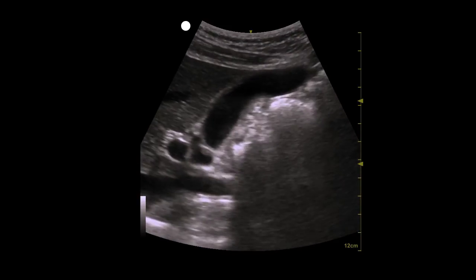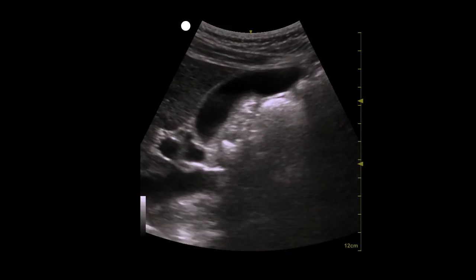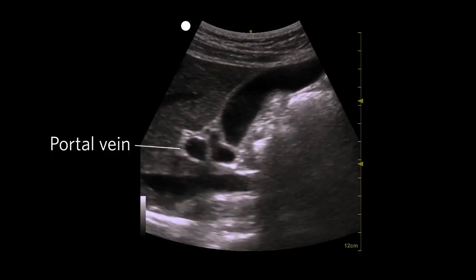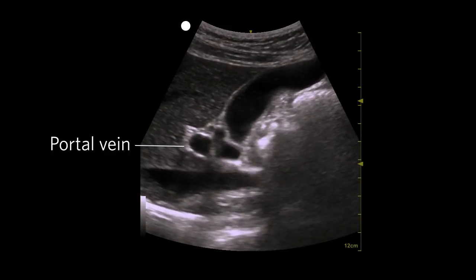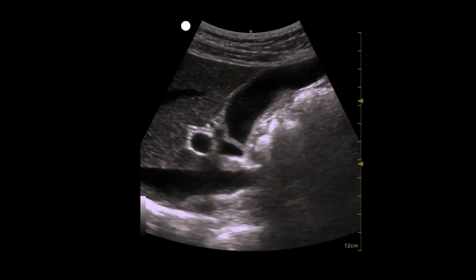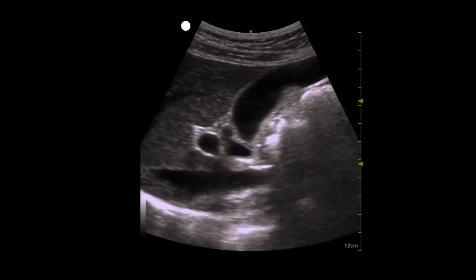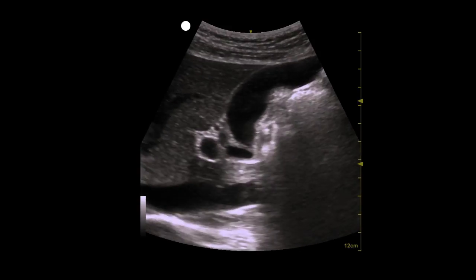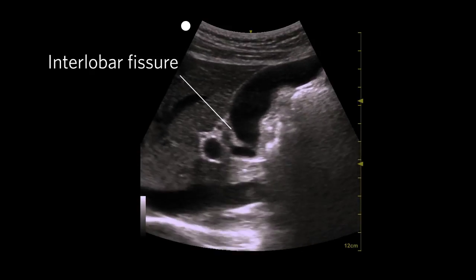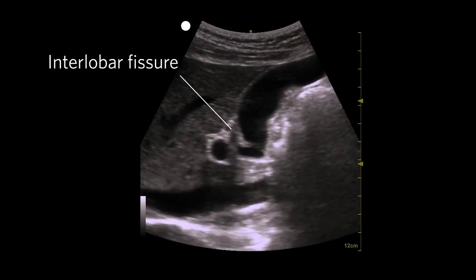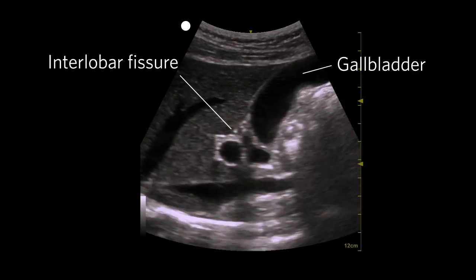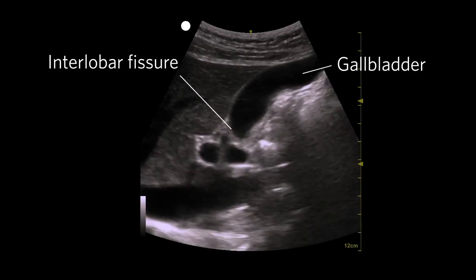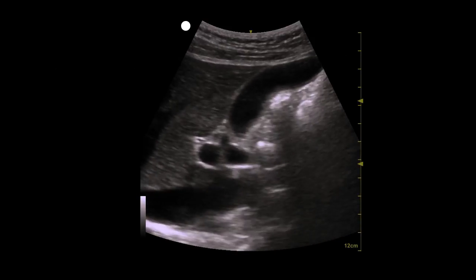Slide the probe laterally along the costal margin until the portal vein comes into view. The portal vein is your landmark — you should identify it before proceeding to the next step. From the portal vein, follow the interlobar fissure until you locate the gallbladder, which is generally obvious from its bulbous shape and large size.